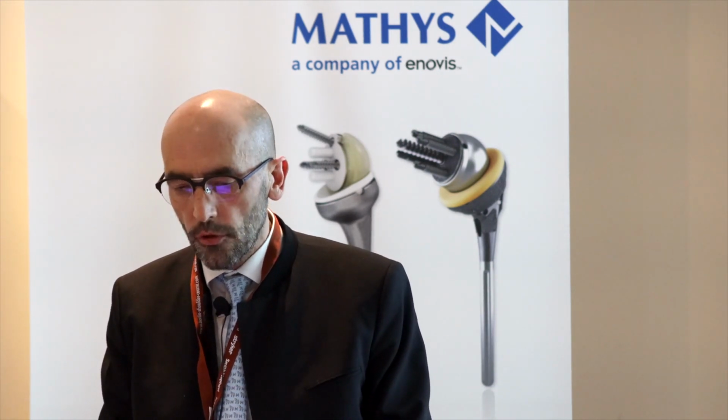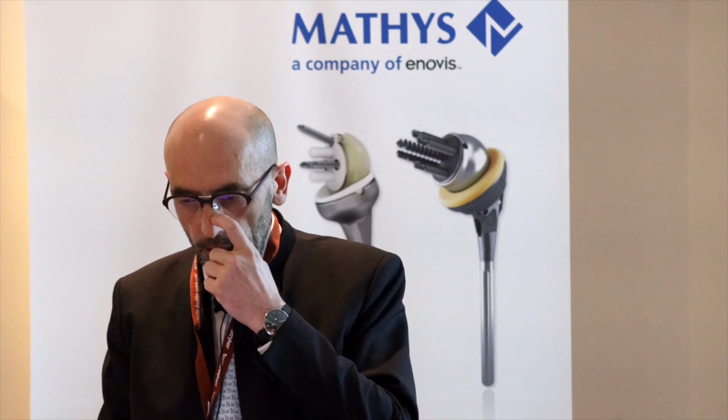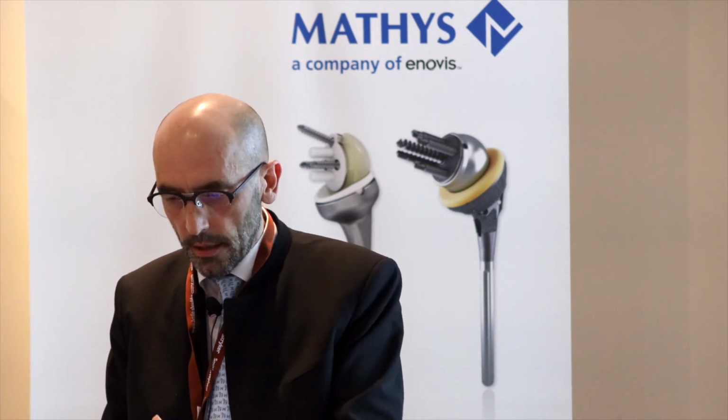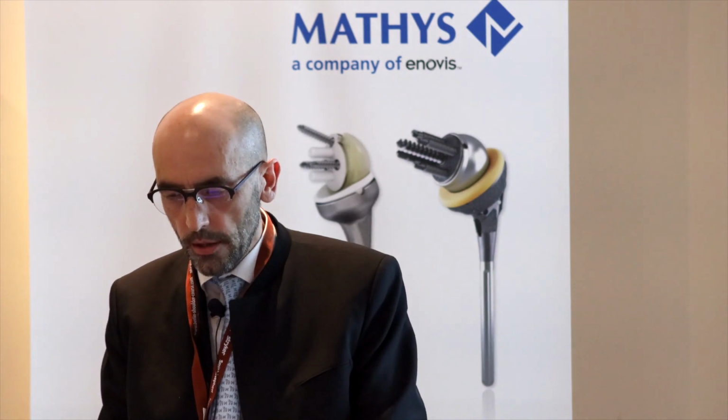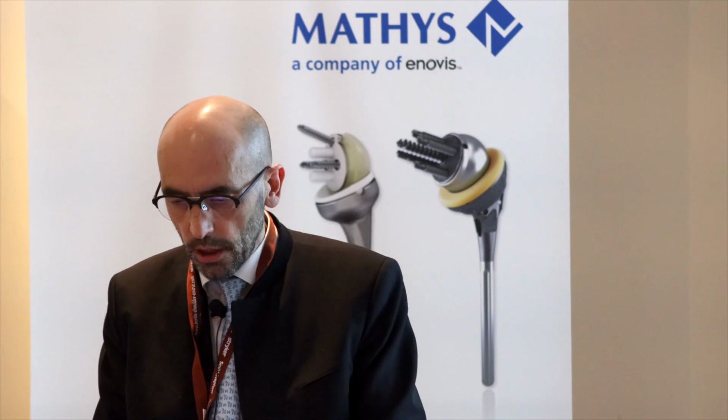As you can see here, you have a normal shoulder, and if you medialize, you can lateralize a bit on the humerus, and you can see that here. That's what you have with biologic lateralization, and that's what you can achieve. The best way to be as close as possible to the normal shoulder is to have a 2/3 sphere.